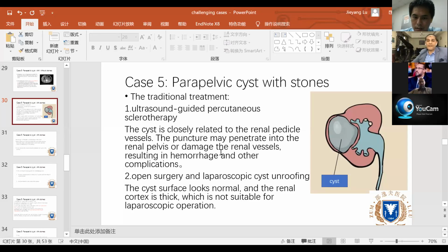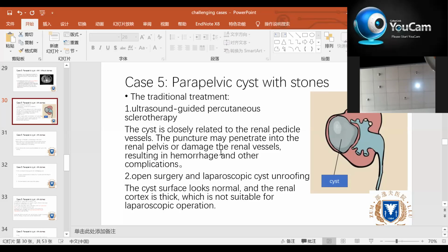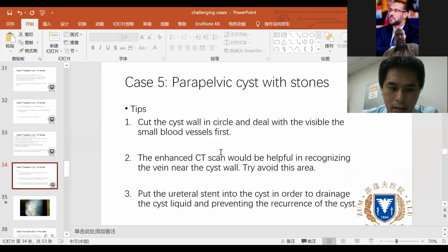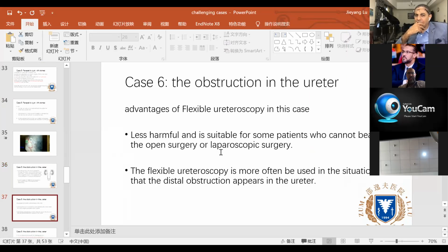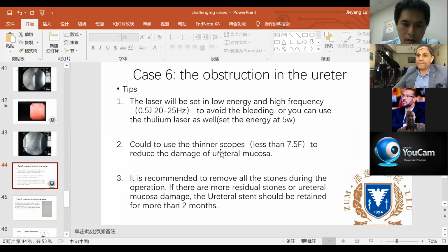Professor Farahat, regarding the case with the stone and suspected papillary growth, we have seen cases where the stone is impacted in the ureter with a granuloma. How did he make a biopsy before doing enucleation of this growth? Because we see cases like this where the stone is impacted and there is a papilloma or another thing, and when he removed this growth, almost the ureteral mucosa is left raw. Regarding what happened to the case in follow-up, did a stricture develop?